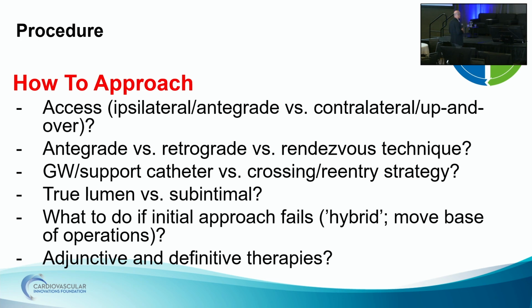But I think then coming from below is a great option here. And then I would do IVUS, so you know what vessel size you're dealing with, and then try to work your way up slowly and steadily in terms of sizing balloons.